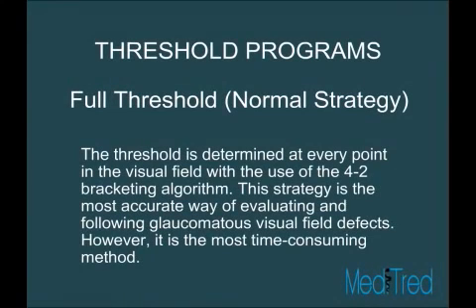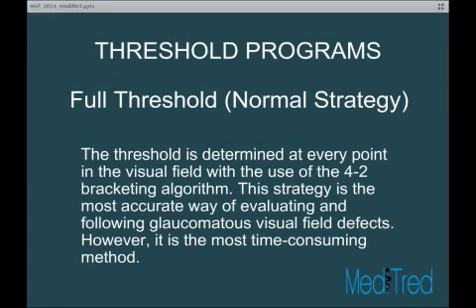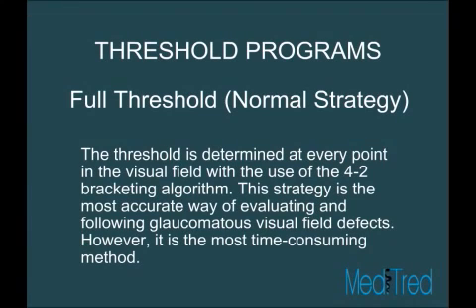A full thresholding program defines the threshold at every single point in the testing field. This is the most accurate way of evaluating and following glaucomatous visual field defects. However, it is the most time-consuming method.